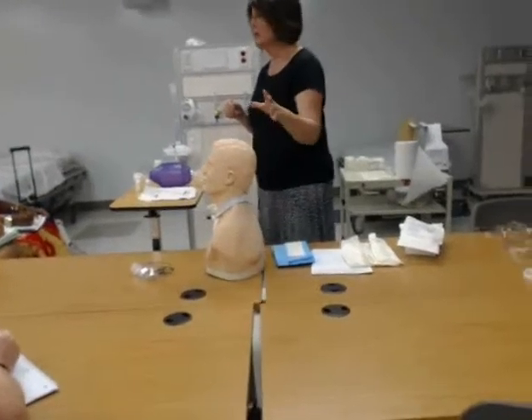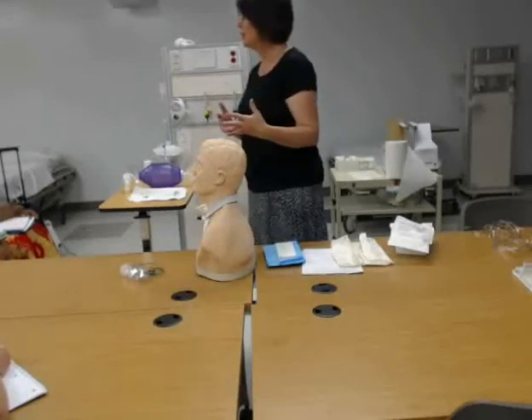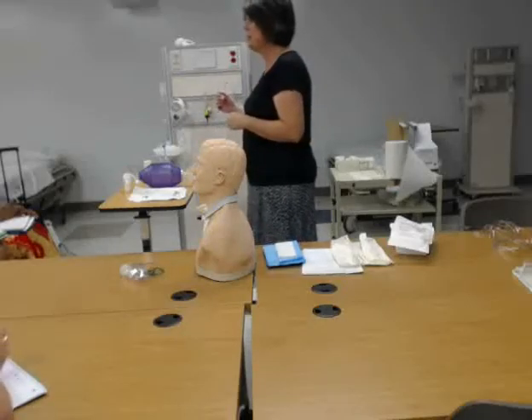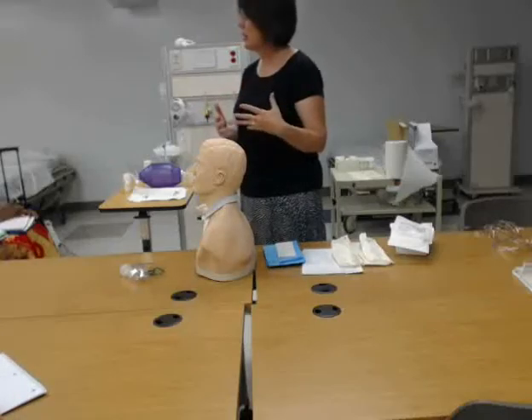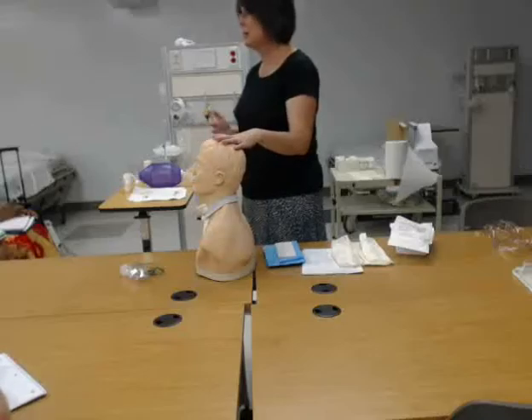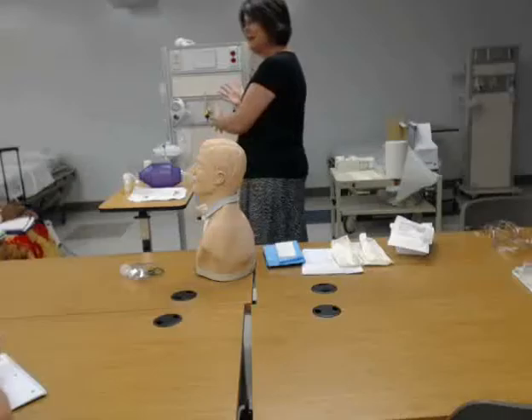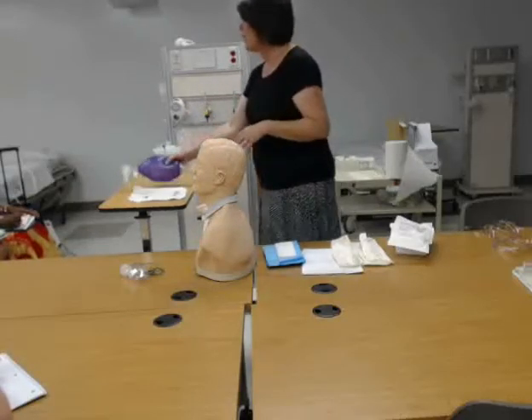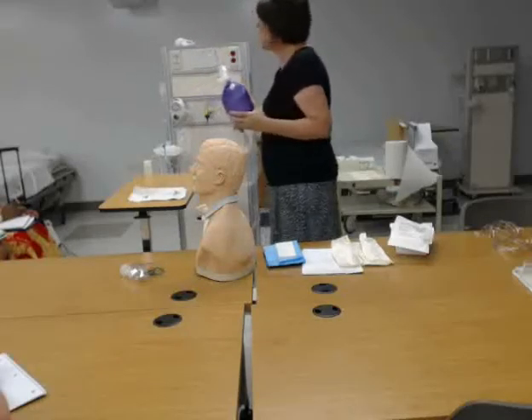We have a patient. This patient has a tracheostomy. There are a few things we have to make sure we do in caring for a patient with a tracheostomy. The first is making sure we always have emergency equipment. Students will sometimes say, isn't it important that we go in and look at our patient first? Well, the problem is if you see they're not doing well and turn to get emergency equipment and there's nothing there, then you're stuck. So every patient with a tracheostomy should have an Ambu bag with a special tracheostomy adapter on the end that's hooked up to oxygen.